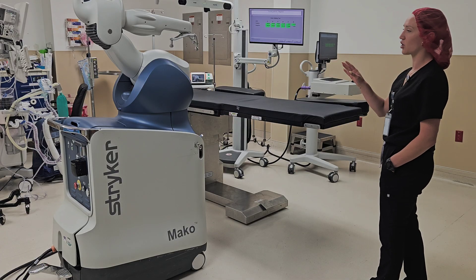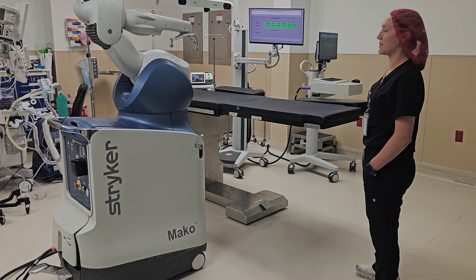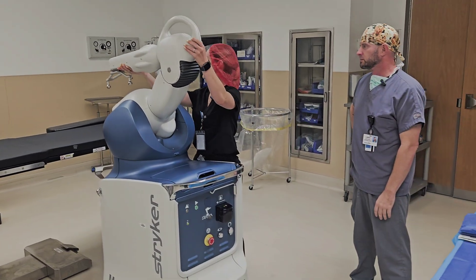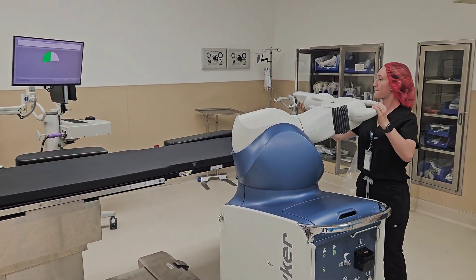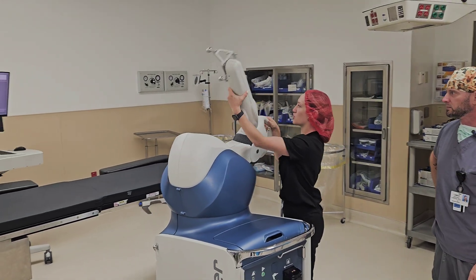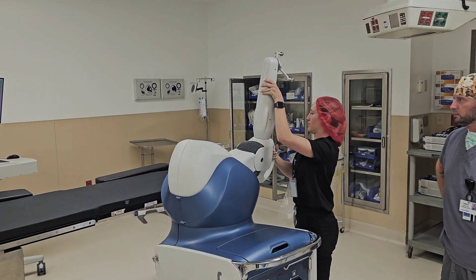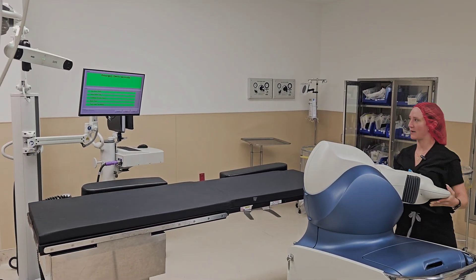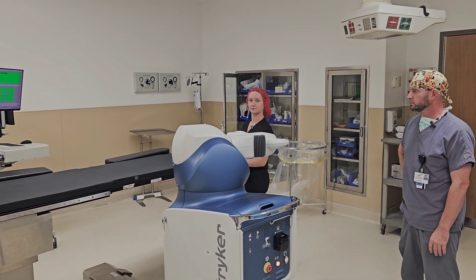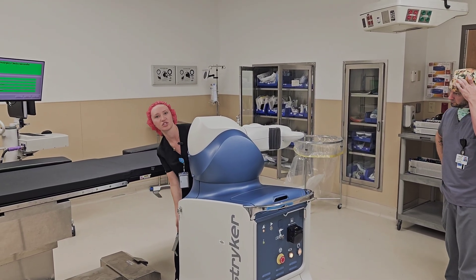We're set up for a right total knee arthroplasty. The Mako system is currently used for hips, knees, and partials. Right now I'm doing a range of motion check, making sure each joint is fully able to move through the full range of motion. It passed all the checks, which means we're good to go ahead with surgery.